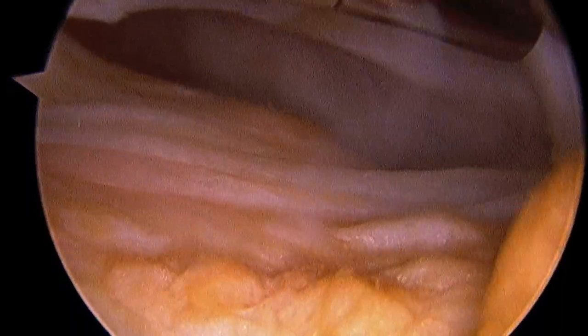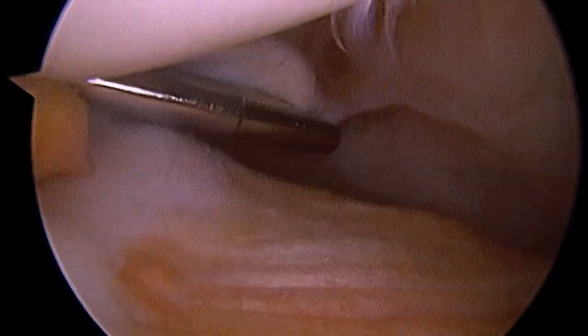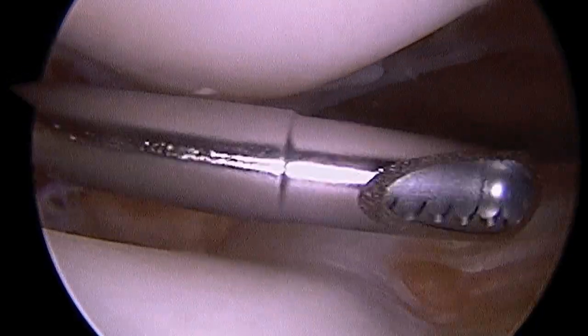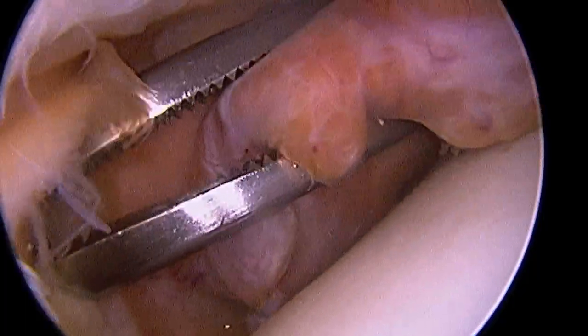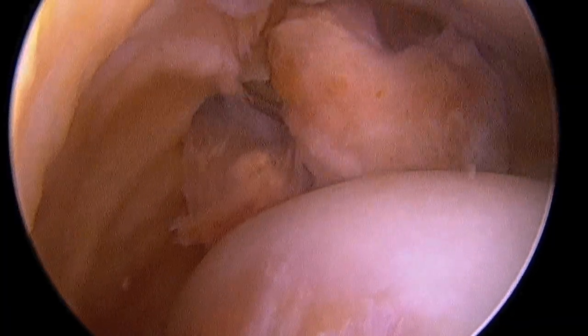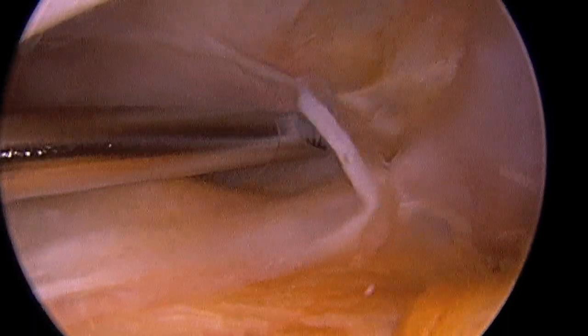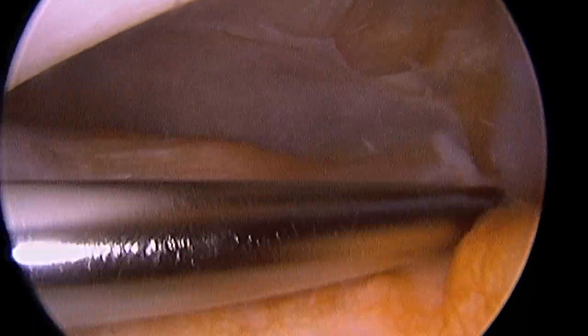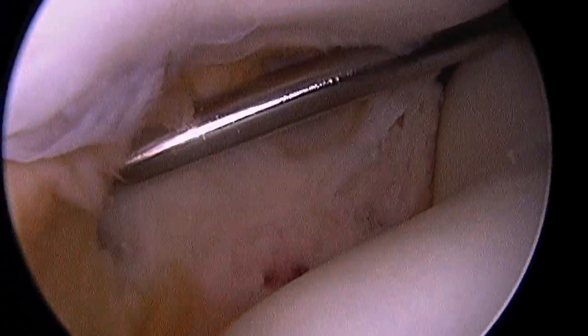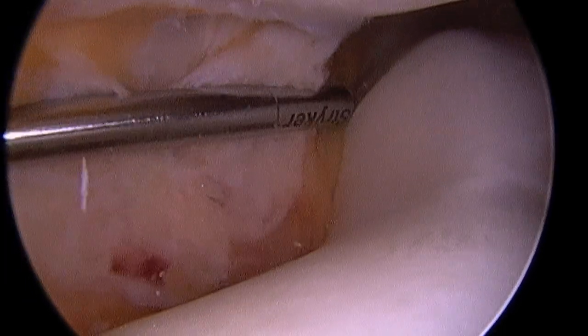Here you see an arthroscopic shaver inserted through a separate portal. We're beginning by excising the plica and the suprapatellar pouch first — that allows us to free up that mass. Then I'm going to take a large biopsy of the mass to send it off to the lab, and then I'll remove the rest of the mass using the arthroscopic shaver. There you see as we bend the knee now, the patella or kneecap runs in the groove with no soft tissue interposed. Here I'm excising the remainder of that suprapatellar plica, and then as I retract the soft tissues again, the kneecap has been completely cleared of any tissue deep to it.